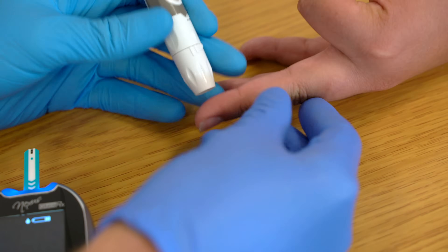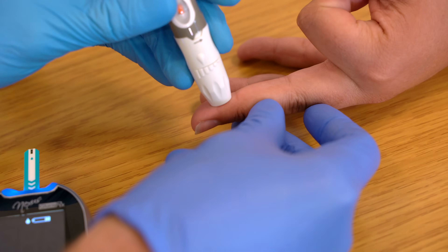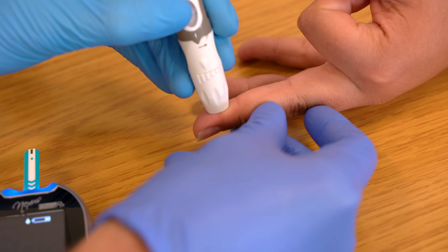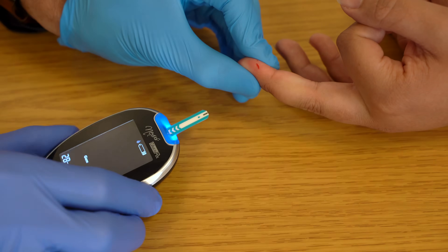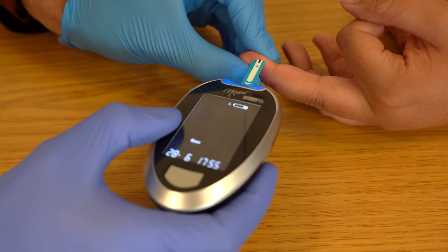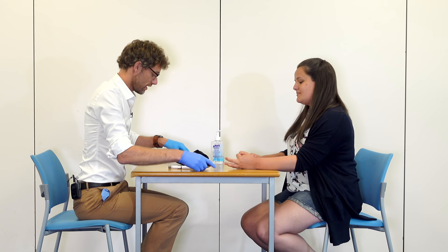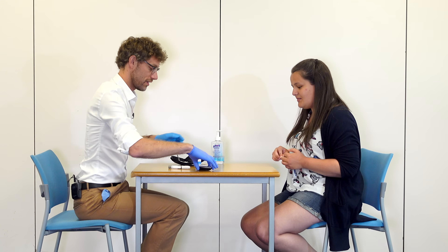We're aware the machine is still on, we've got the correct date and time, and it's asking us to put the blood on. If you could just move your finger around — super, thank you. So we're just going to fire on the outside of your finger. One, two, three — fire. We've got a little bit of blood there, that's good. And if we just get you to hold on to that, that should stop nicely.